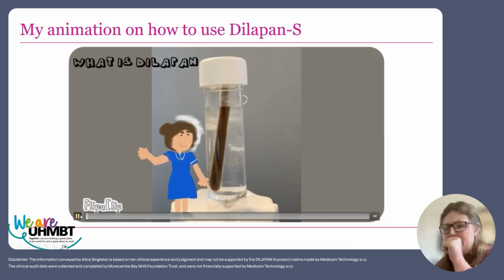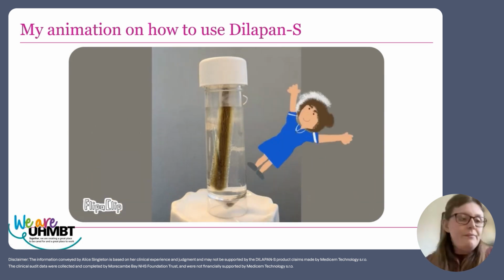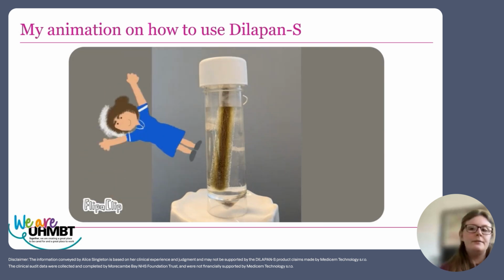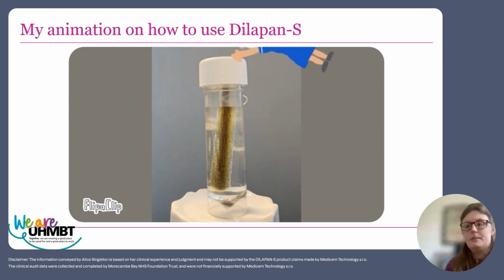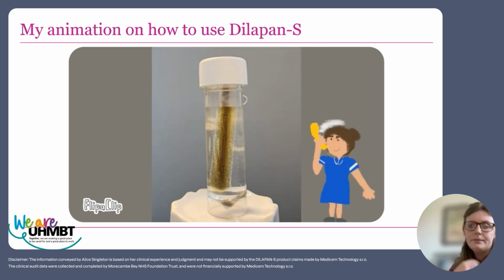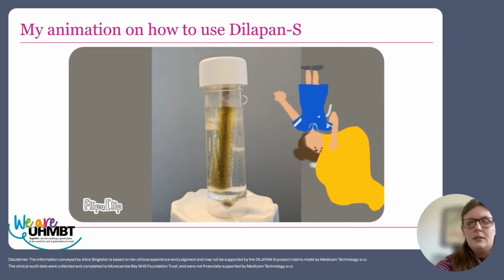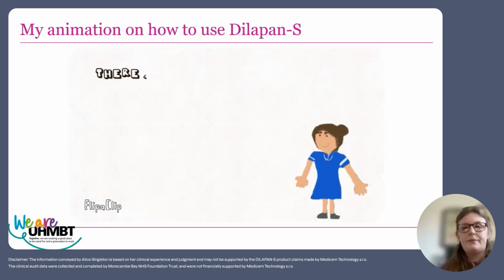Hi everyone, so I thought today we'd talk about Dilapan, seeing as it's such a new thing to us midwives. In the background, I've just done a time lapse of a Dilapan in some water over 2 hours, and I've just sped it up just so that you can see the process of actually how quickly they grow and what they look like. As you can see, it's not really an instant process, but they very quickly change consistency and colour. So let's have a look at how do we actually administer Dilapan.